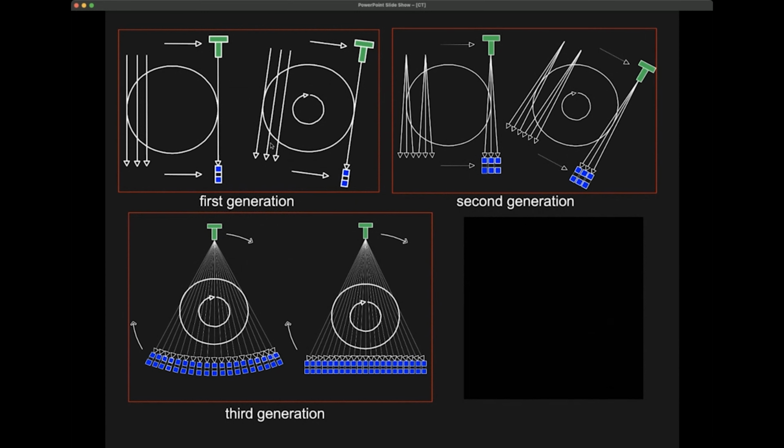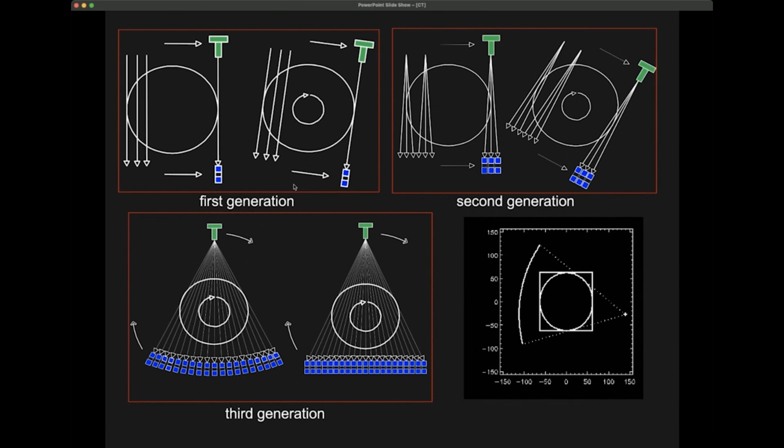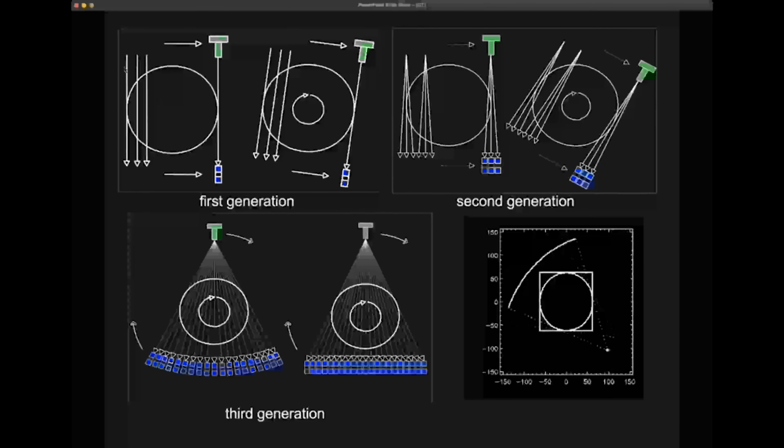The difference between the regular X-ray, like the X-ray thorax, the projection X-ray that we said before, and CT, is that we're going to make projections from all directions. So what we're going to do is take an X-ray source. We're going to take a detector.